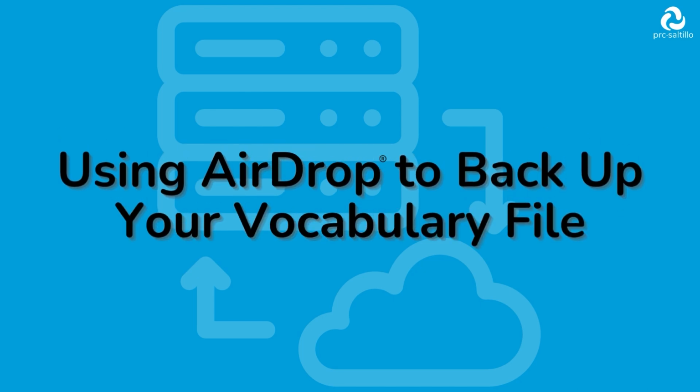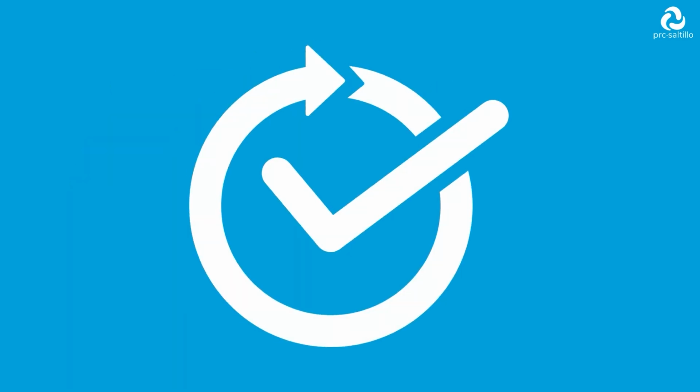Today, we're going to show you how to back up your customized vocabulary file using AirDrop, a quick and easy way to keep your custom file safe and sound.